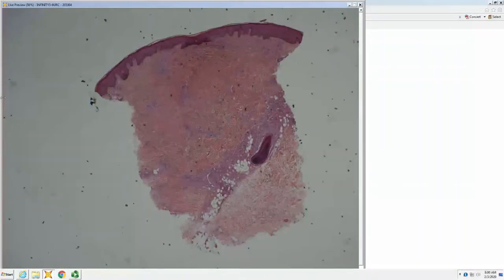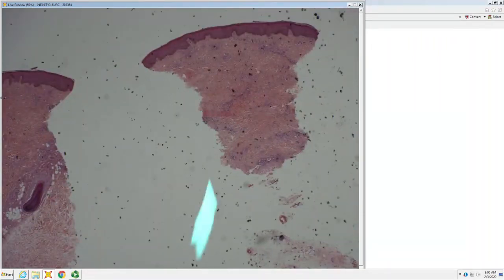You've got a busy dermis. It looks kind of patchy, and it's patchy around what? Around adnexa and around pre-existing vessels, and around pre-existing erector pili. So what is busy, but patchy around every pre-existing structure in the dermis? Anyone? Kaposi's, KS. Lupus would give you peri-adnexal lymphocytes, but here you've got a busy dermis, see little crack-like spaces in there? So little crack-like spaces, busy, and patchy around every pre-existing structure in the dermis is Kaposi's. That's what plaque Kaposi's looks like.